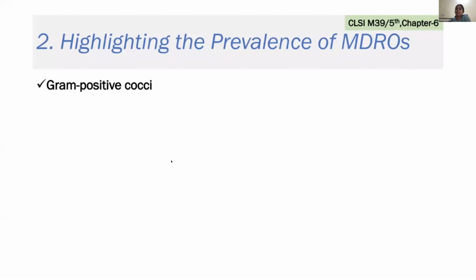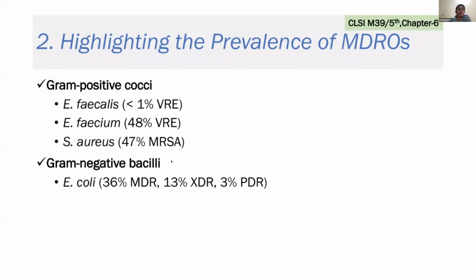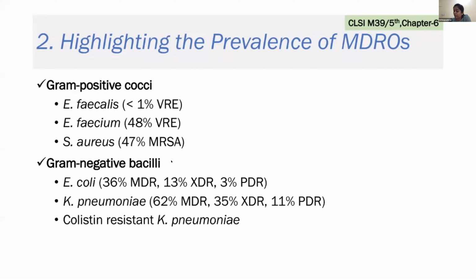Okay. So there is another type of antibiogram that can be generated, based on the prevalence of MDRO. In your antibiogram report you can include the details of MDR isolates. For this you should remember one important point: you can only report these MDROs if you're testing that particular antibiotic routinely. Say suppose you're doing colistin MBD but you're not doing it for all isolates. If you're doing it only for resistant isolates as a second set of drugs, because you're not doing it for all routine isolates, you cannot include it in your antibiogram.